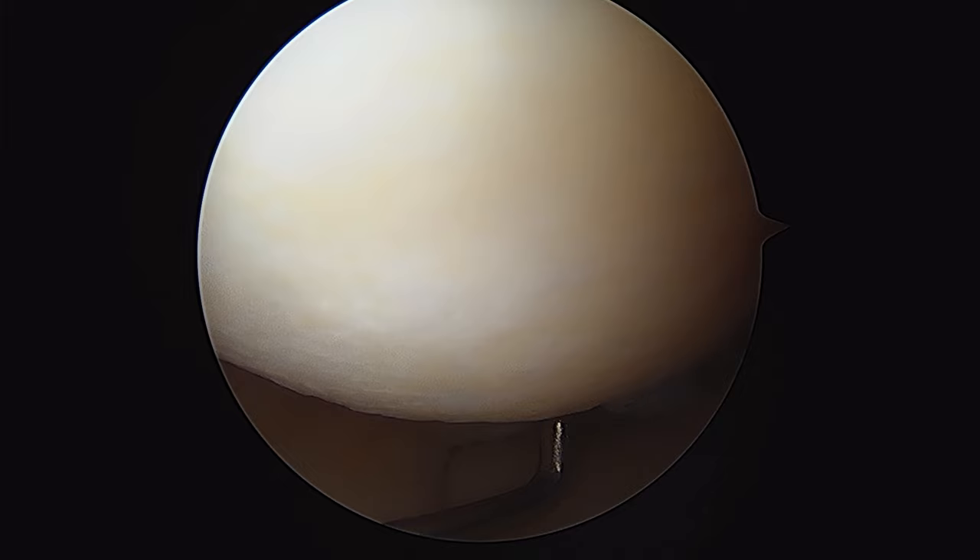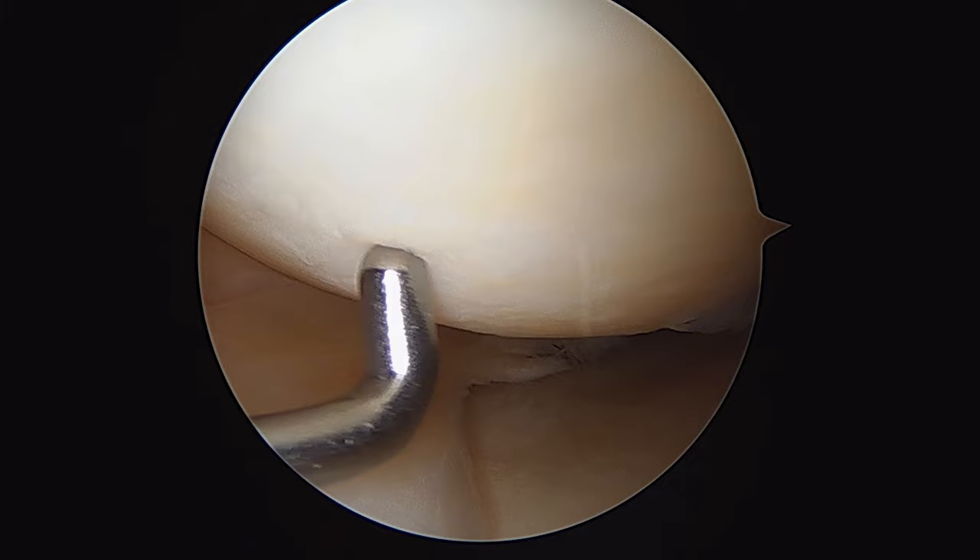All right guys, we're in this patient's left knee. This is an NBA basketball player who's been experiencing medial joint line tenderness for the last few months.